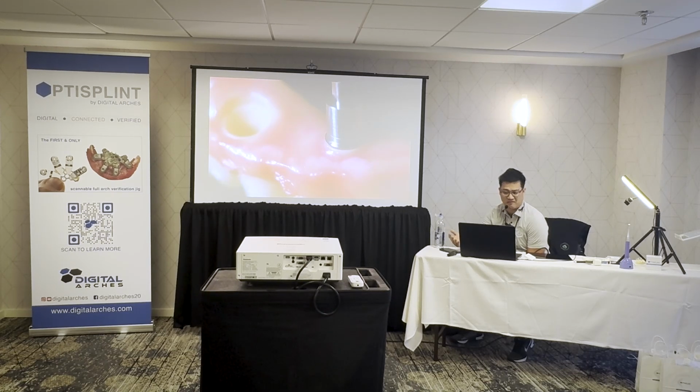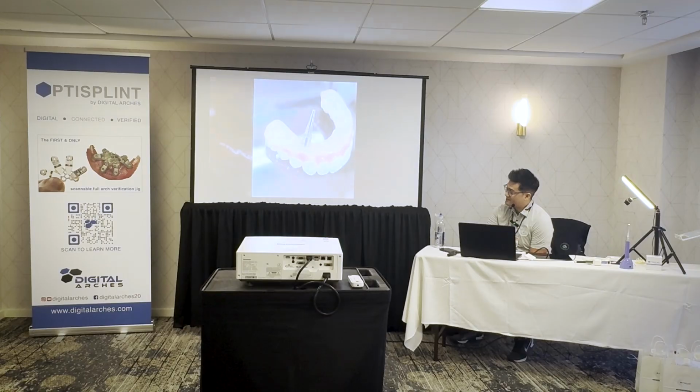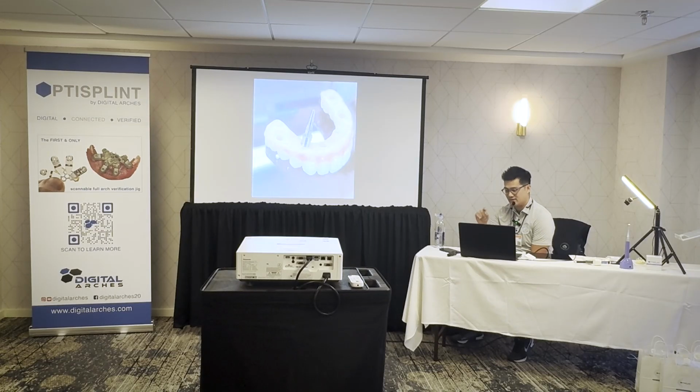That's about average. So this is the same case, with a tie base in here with an analog, and you're seeing a wiggle on this, and this is 50 microns. That's how much movement you get at 50 microns. That's a lot.